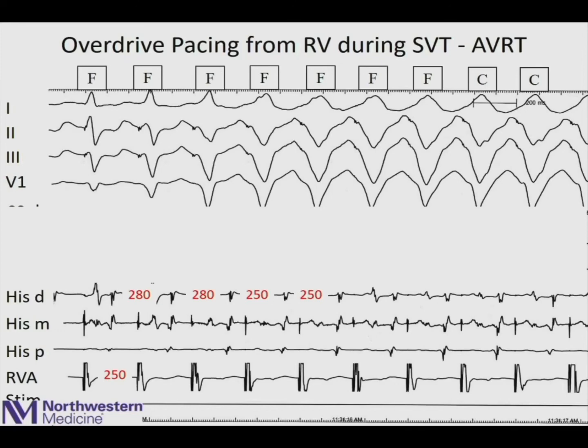Therefore, if anywhere in here you paced in the ventricle and you advanced the A, you got back up to the atrium, it was not through the His Purkinje system, because we know that was refractory because you came down it to generate part of the fused QRS. Does that make sense? So anyway, that's just to clarify, because a few questions came up on that point.